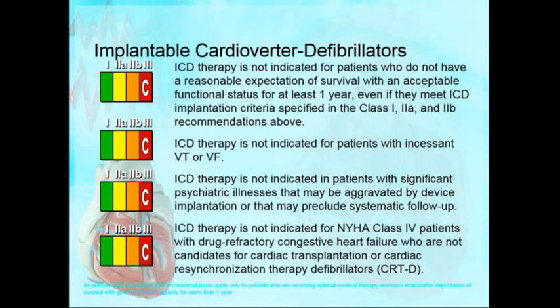But you're obliged to offer. It's class one. If you don't offer, you did not do the right thing. Because if he has a cardiac arrest, he'll come back and say, nobody ever offered us this for that cardiomyopathy. But it's very expensive. The ICD industry itself is very expensive.